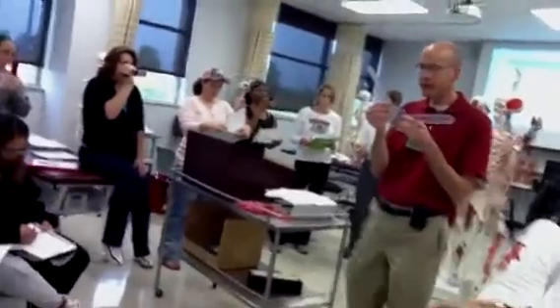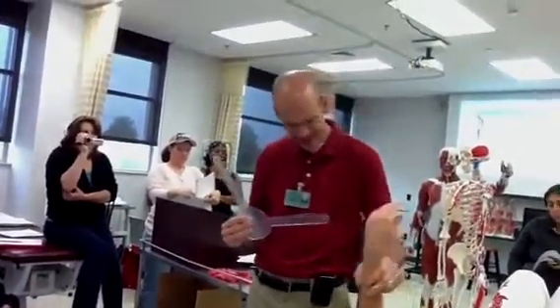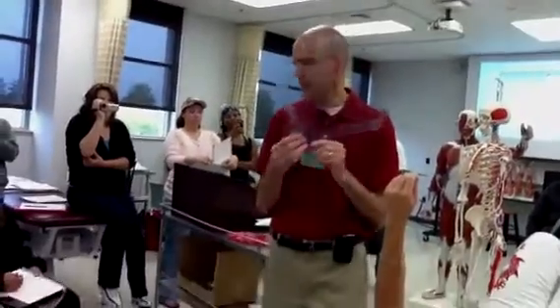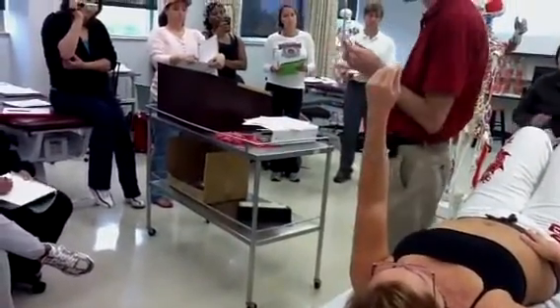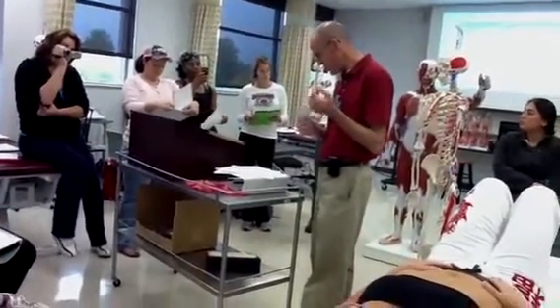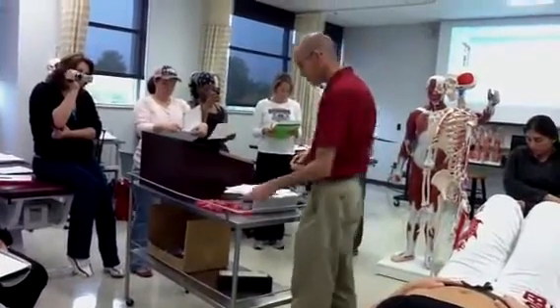What if I looked at it and I got 82 degrees? So I'm looking at it, that looks like it's more than 90. Why am I getting 82 degrees? I'm reading the wrong end. Again, that's why we do the visual estimation at first. Make sure I'm reading the right end of the goniometer. Okay, so number 8, read and record the correct goniometric measurements.